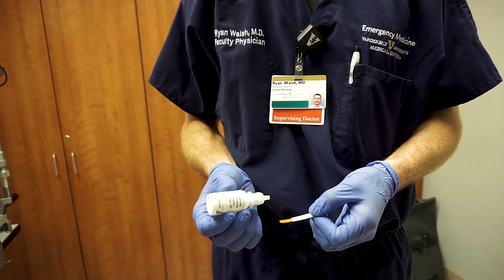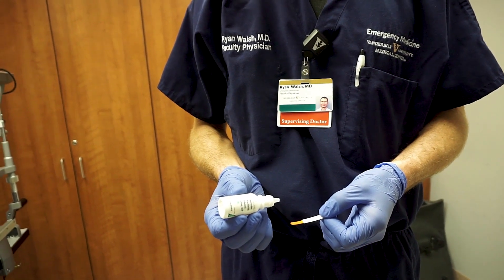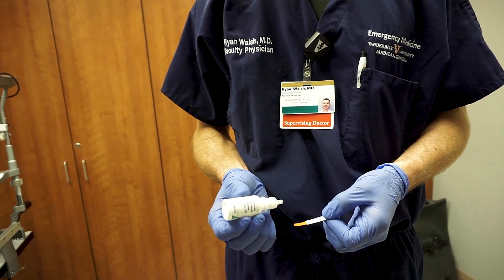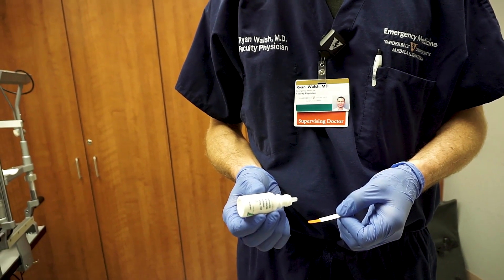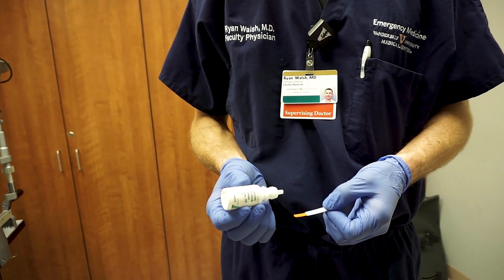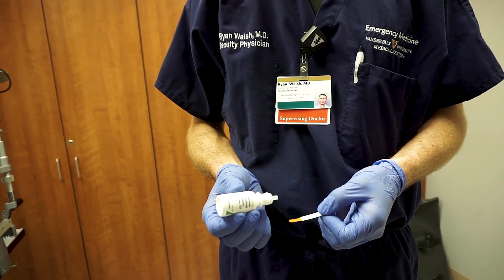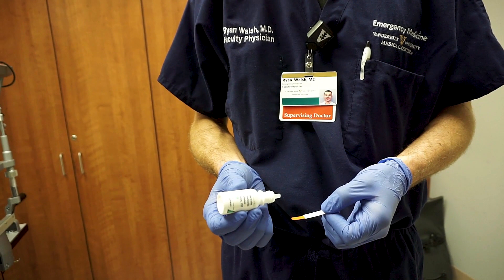Do not apply the fluorescein to a suspected infected eye and then use the same strip for the other eye, as this can result in iatrogenic transmission of infection. Another word of caution is to ensure you remove the patient's contact lenses prior to applying fluorescein, as this will cause permanent staining of the contact.